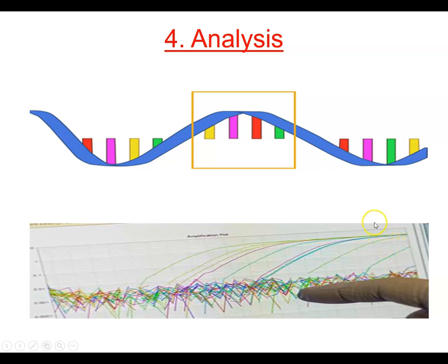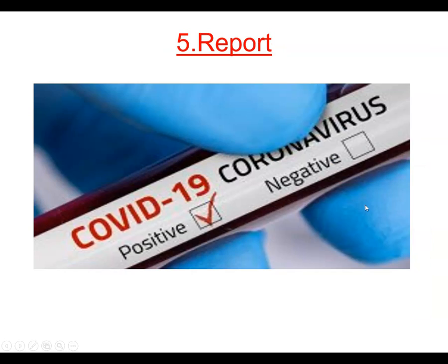Based on this analysis, if you are positive, the doctor will give you the COVID-19 positive report. That's the report you will get. The entire procedure needs highly professional people to do the design and analysis, but as a patient, it's very simple.